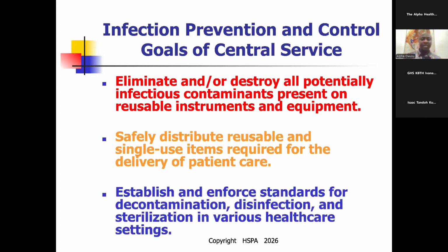Again, establish and enforce standards, right? The doctor said we are going to get to where, if your hospital does not get a certification, an accreditation from Ghana, the way the doctor and Ghana Health Service will name it, either infection prevention or IPC sterile processing advanced accreditation, if your facility does not get this accreditation and you don't meet or follow all these standards, hey, you are not going to be allowed, right? So standards are going to be enforced for the decontamination area.